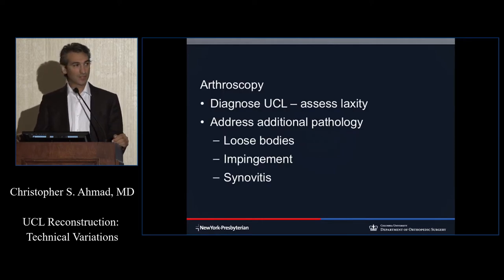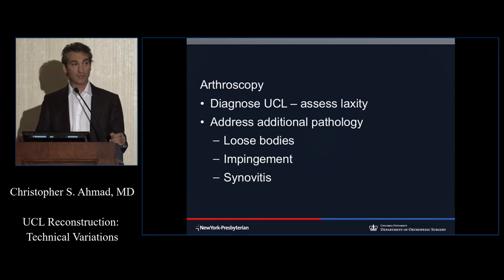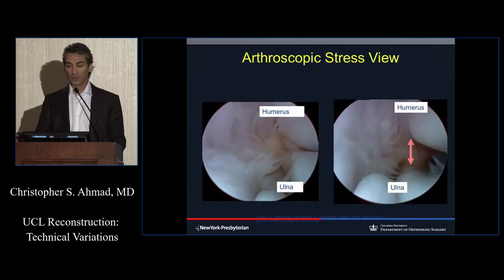Arthroscopy, when patients say, you do an arthroscopy outside of a ligament, patients and the family always say, how did the UCL look? And you say, I can't tell you how it looked, because with the scope, you can't see the ligament. You might be able to see some lining of it, but you really can't see it with the scope. But you can assess laxity, just like a stress view, and see if the joint is opening up. But really, it's important for loose bodies, impingement, and synovitis. This is what it looks like if you're looking at the ulnohumeral joint.